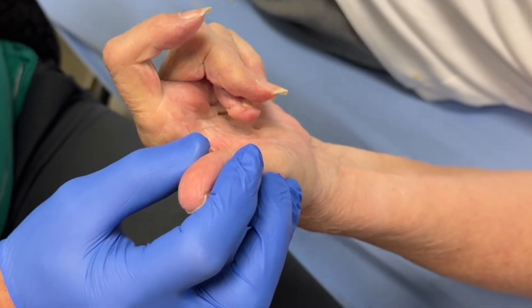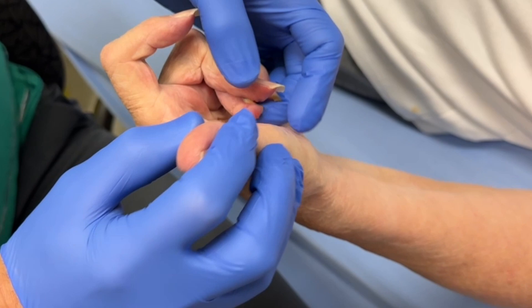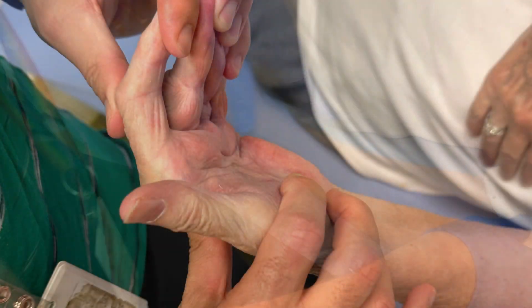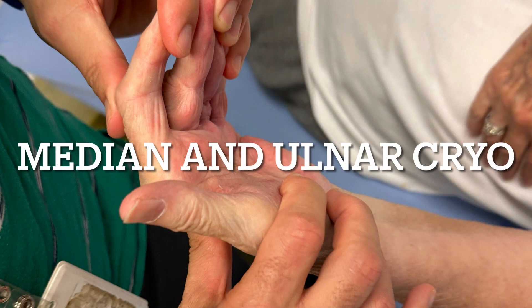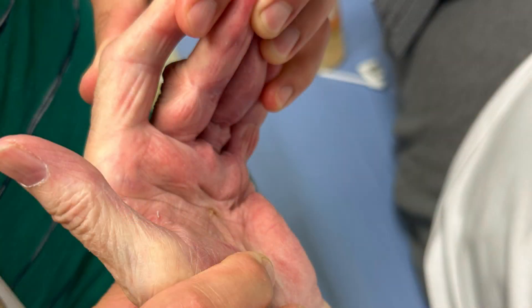We go on to do an above elbow median nerve block, and below elbow the FCU and the ulnar nerve below the elbow, because the wrist was also tight. This is immediately followed by cryoneolysis, as there was no sensory disturbance.